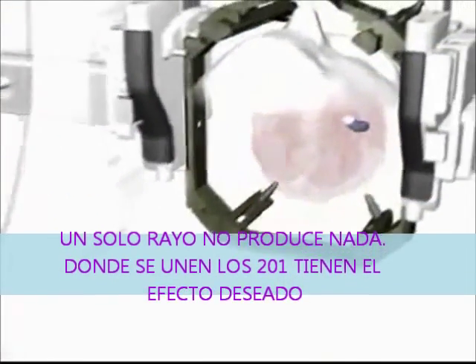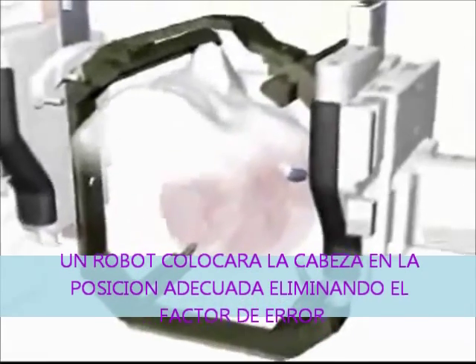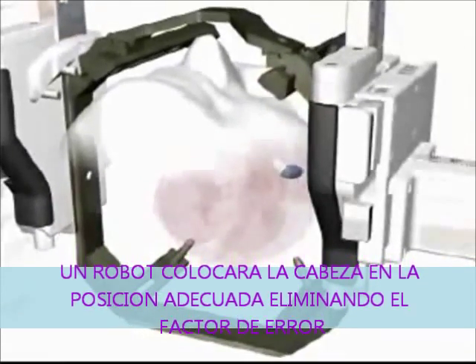This can be compared with the principle of a magnifying glass in the sun. By placing the head in one or several positions, the shape and dose of radiation is optimized to affect only the target, without damaging surrounding healthy tissue.